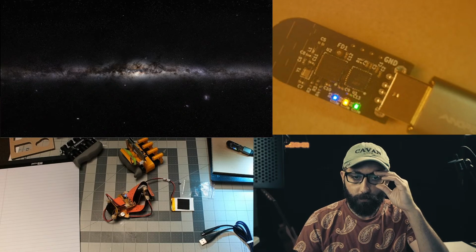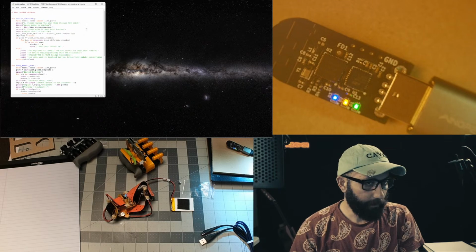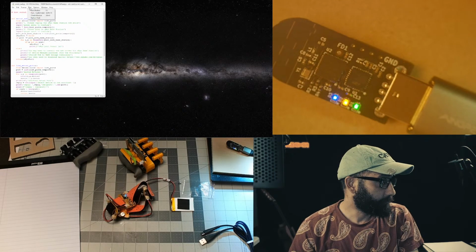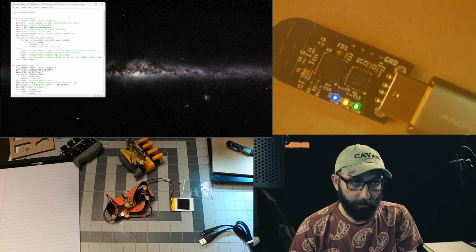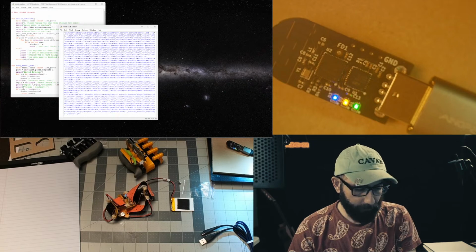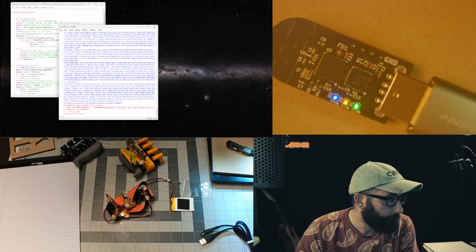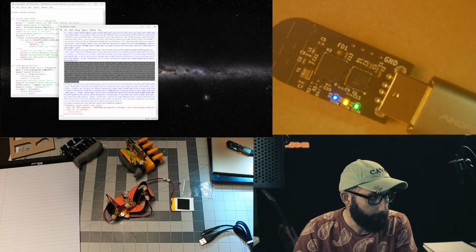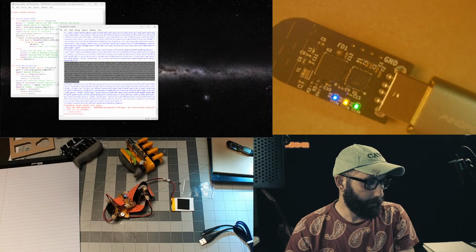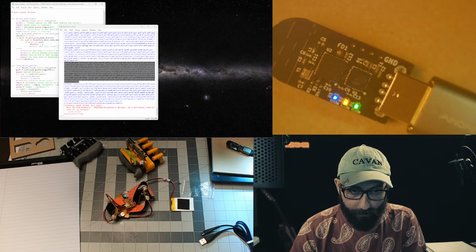Okay, so gonna open up serial read again. And let's see why we got that error. That error is actually nice to know. We'll run the module again. Select the port. We get some data. Perfect. So still getting data. Still working. And these might not be individually chunked like this. It's possible that the data is structured differently.